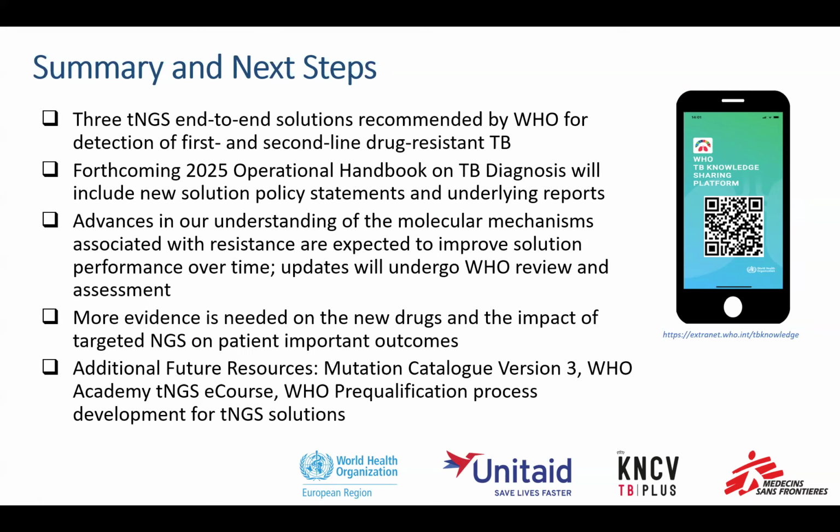Advances in our understanding of the molecular mechanisms associated with resistance are expected to improve solution performance over time, similar to what we saw with the Ampore TB, as we understand more of the mutations that underlie resistance and can reflect those in the WHO mutations catalog. Then manufacturers can update their solutions to improve performance, and these updates will undergo WHO review and assessment.